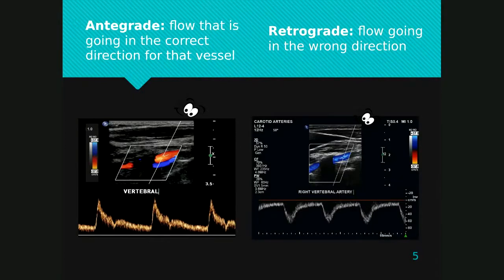So let me go over a couple of things on this slide. First, I know we haven't gotten to the color packet yet, but I want to make sure you understand that when you're looking at a color map and reading the information on a color map, the color on the top is the positive color assignment and the color on the bottom is the negative. So let's look at both of these scales.